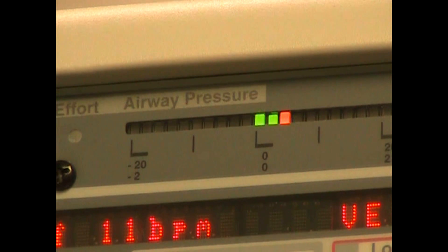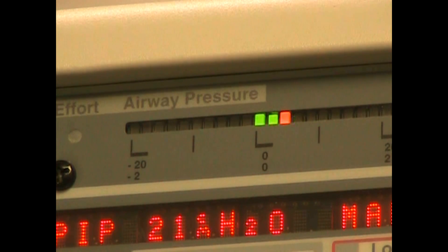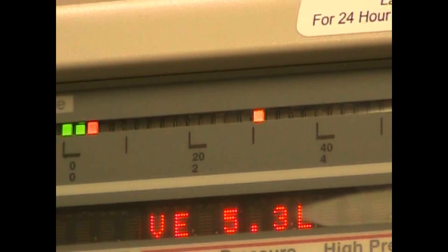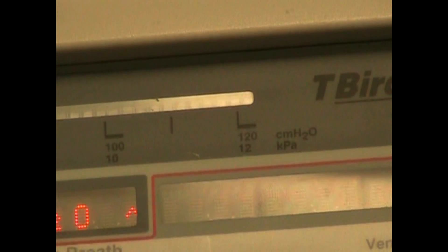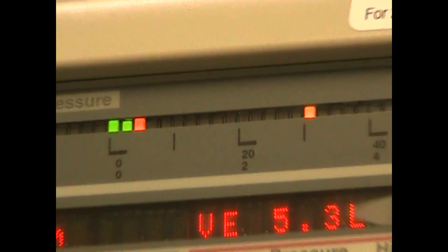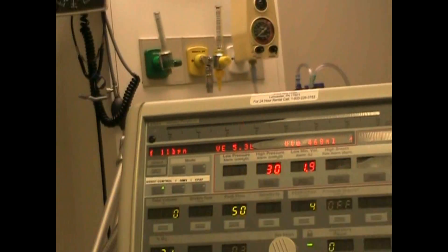Our manometer starts with zero in the middle and goes down to negative 20, then goes in units of 20: 40, 60, 80, 100, 120. And so we have our digital pressure monitoring.